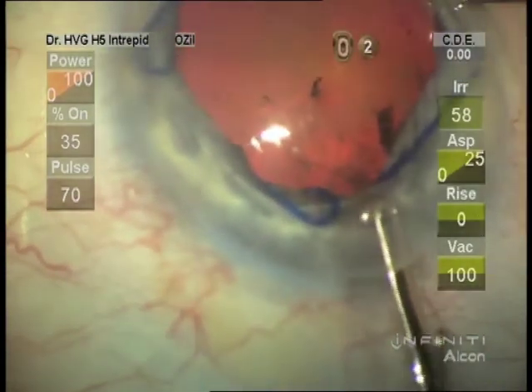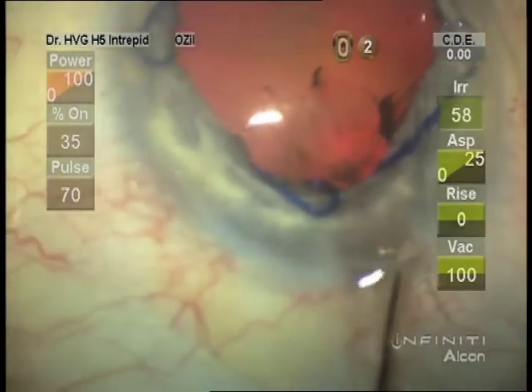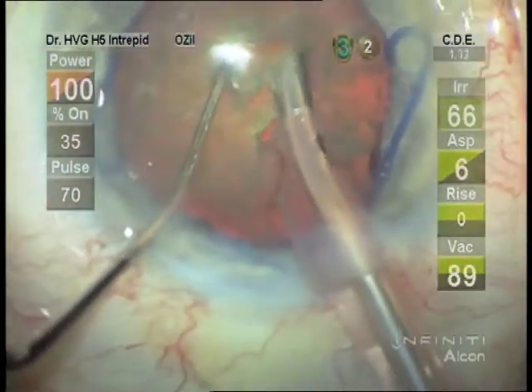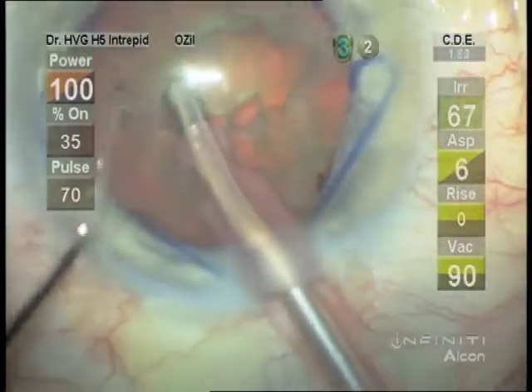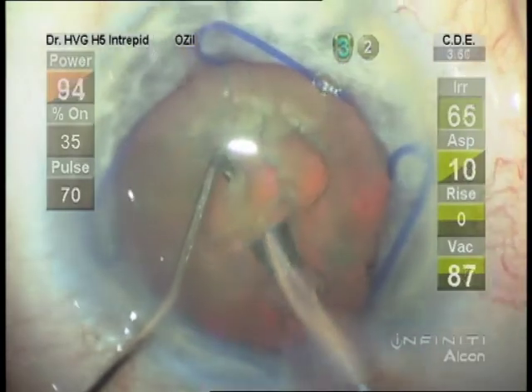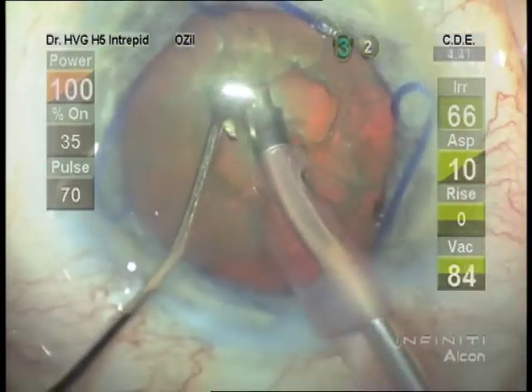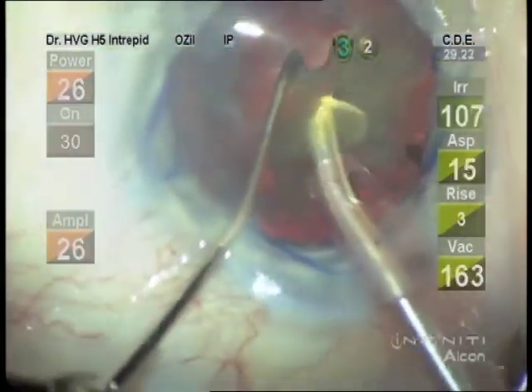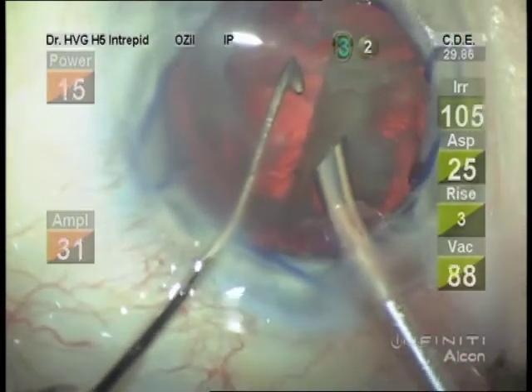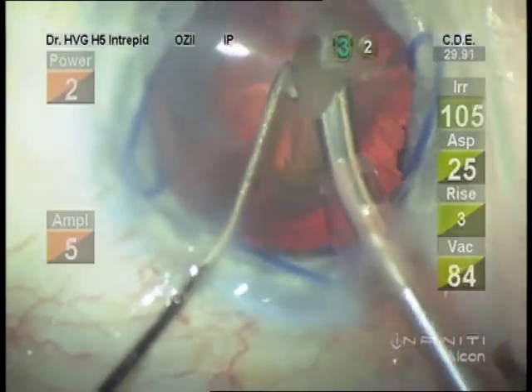One has to be careful releasing this loop that it doesn't slip under the iris. It can be retrieved through the paracentesis with the synechiae hook, but it's best if that can be avoided. So now we certainly have a nice big pupil to do the phakic lens implant.